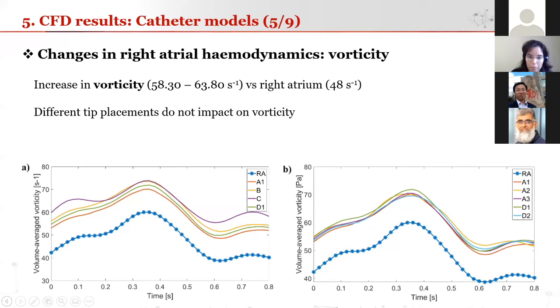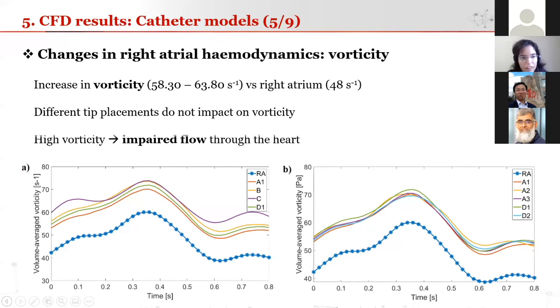However, different tip placements did not impact vorticity. On the figure on the right, we have all the different types of placement which we tested, and the temporal profiles are quite similar. So different placements did not affect this.